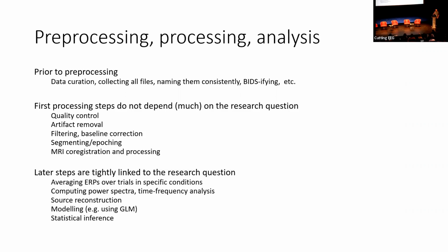And it's the later steps in the analysis that are usually tightly linked to the research question. And it's always a little bit difficult to say where does pre-processing end and where does the processing start? Or where does the analysis start? What's the difference between processing and analysis? And usually it's a gradual distinction, but at a certain point, the research question becomes more important.